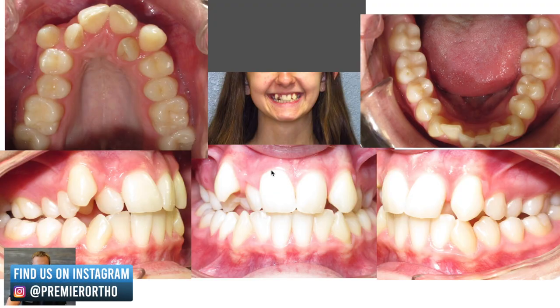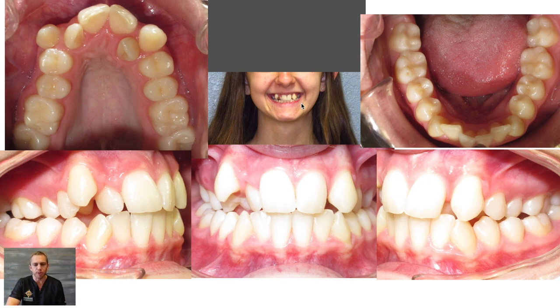Her case also had quite a bit of crowding top and bottom. And just when you look at her, her smile is really narrow — you can see when she smiles that her arches just look too narrow. So in order to treat her, we wanted to expand her upper arch as well as do braces to help fix the bite.